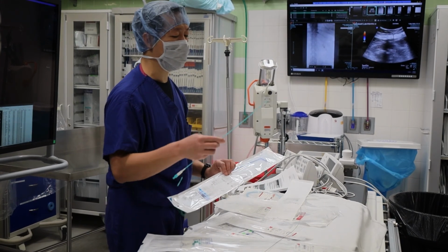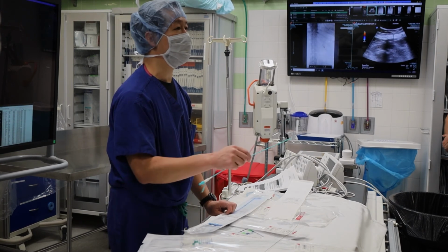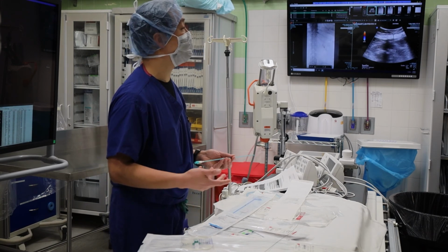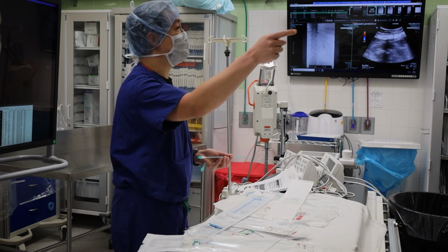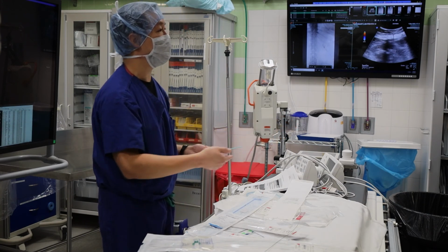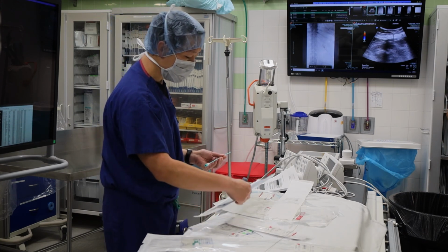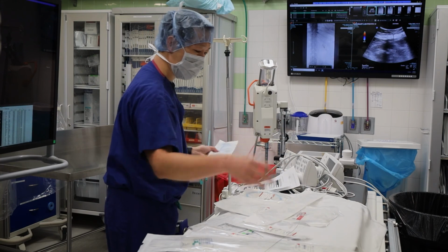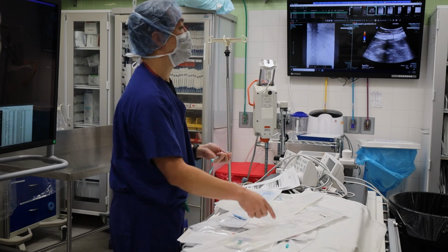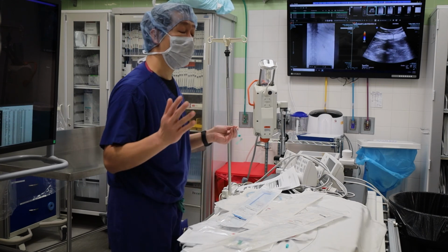And I've actually had a case where I had the wire in, and I wasn't looking at what was loaded on the tube, and then I put in the tube. I was wondering when I was advancing, wow, this tube feels longer than normal. But I didn't look down, and I was just staring at the monitor, and all you see is the front pigtail form. Then I looked down, and urine was leaking out the entire way, and I saw like 8 side holes sticking out from the skin. One of these got loaded on instead of this. And so essentially that soaker hose was just leaking pus all throughout their belly.